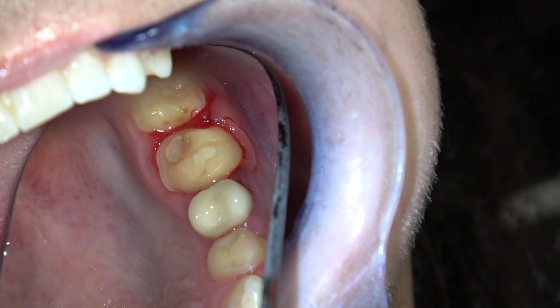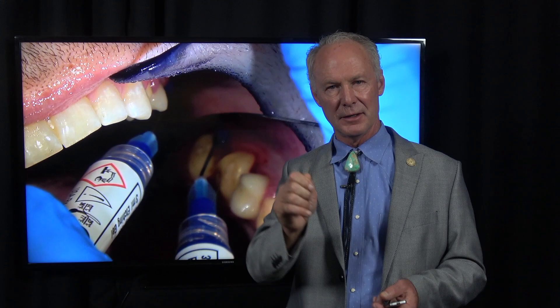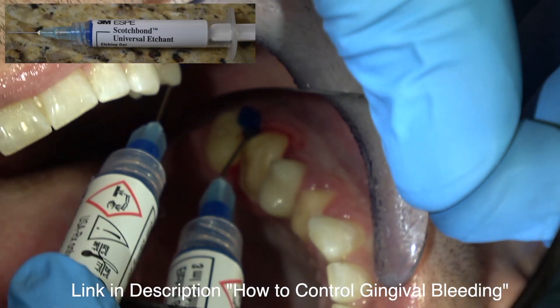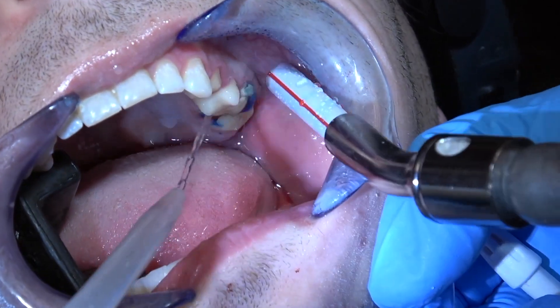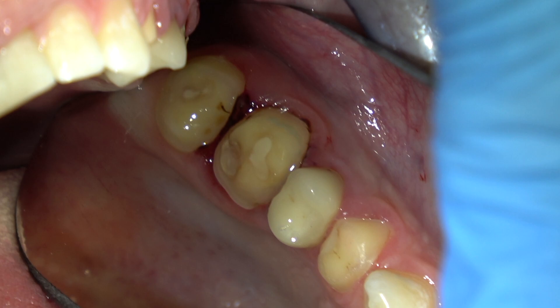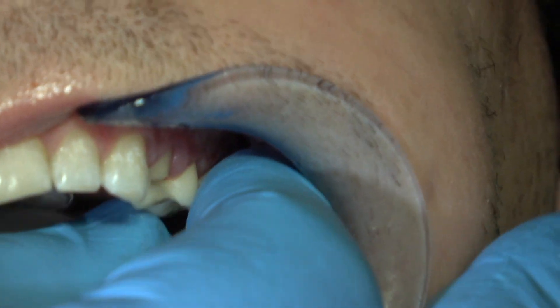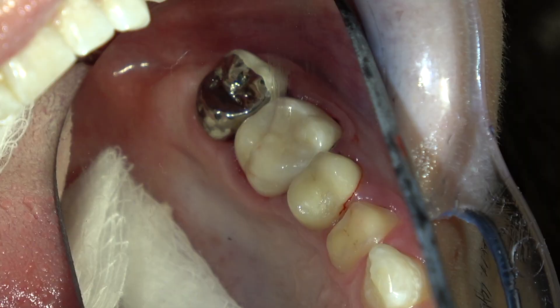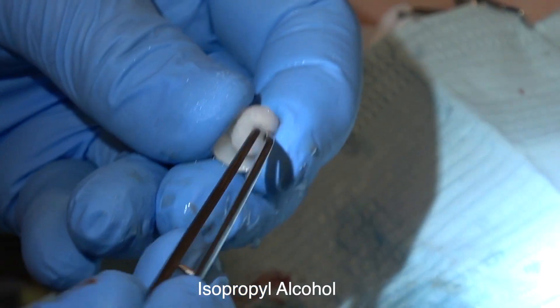Then go to the other side. Work out the seating and the occlusion on one side before you go to the other side — then you're not chasing contacts. You can get the occlusion perfect on one side, then seat the restorations on the other side. We've got bleeding back here — this guy's home care was really not good at all. So leave the phosphoric acid for 45 seconds, then rinse it off with the cold water in the water bottle. Putting the crowns to place and checking with unwaxed floss — we're trying them in and checking because unwaxed floss will break if the contact is too tight. Then treating the Emax crowns appropriately and wiping them all with isopropyl alcohol.